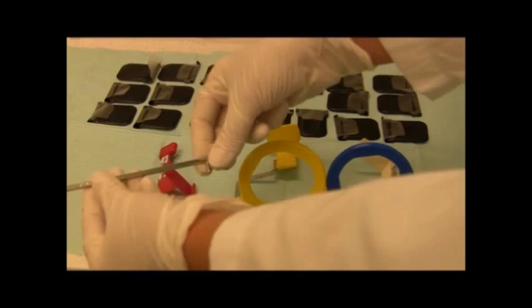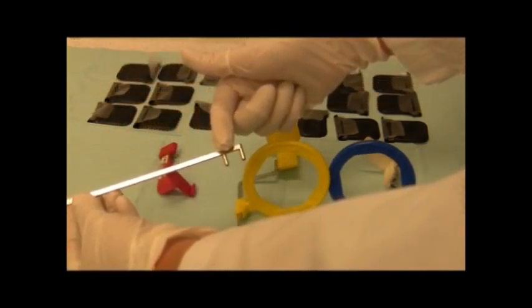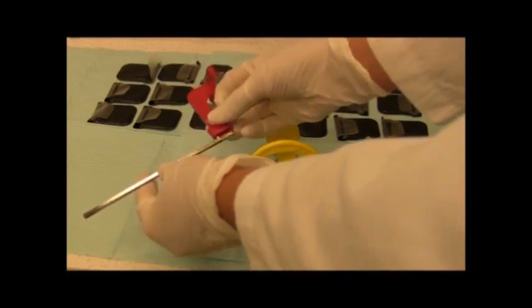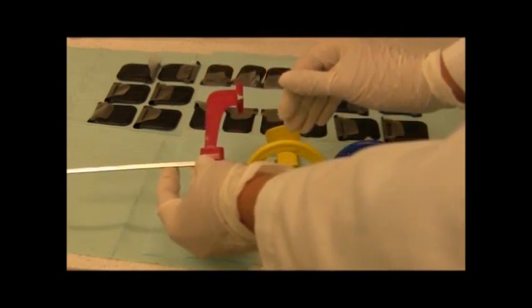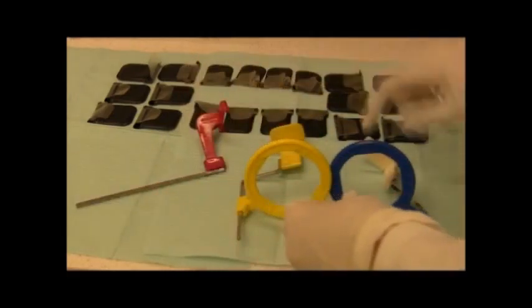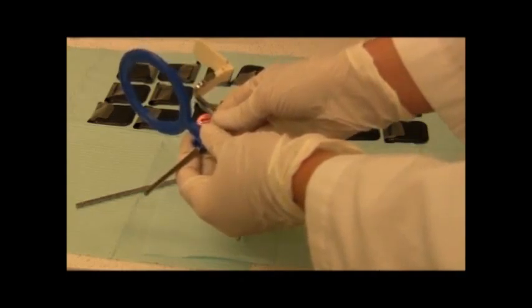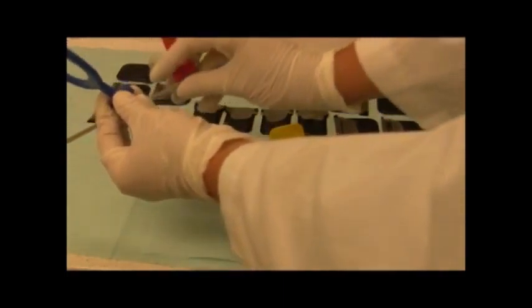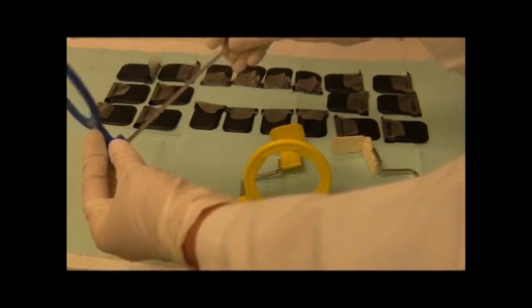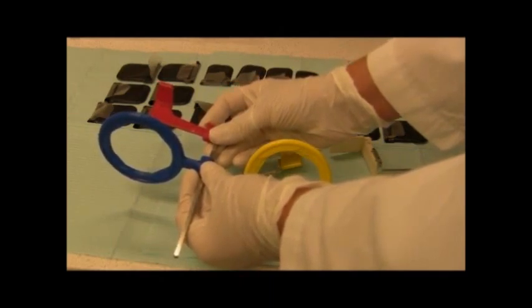The alignment rod without any bends is the alignment rod for use with your bite wing images. The alignment rod and bite block should be assembled so that the whole structure resembles that of an airplane tail. The ring for use with bite wings is the same ring that we use for our anterior periapicals. This is the proper assembly for both right and left side bite wing images.